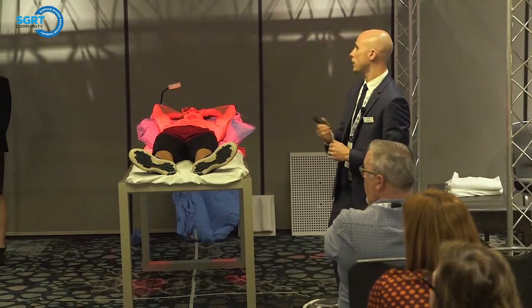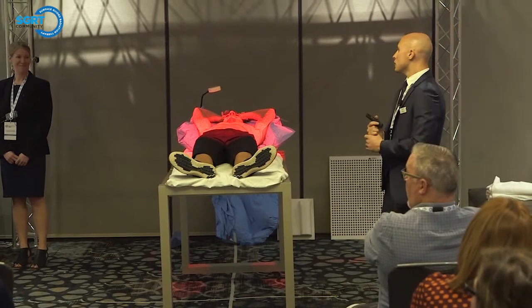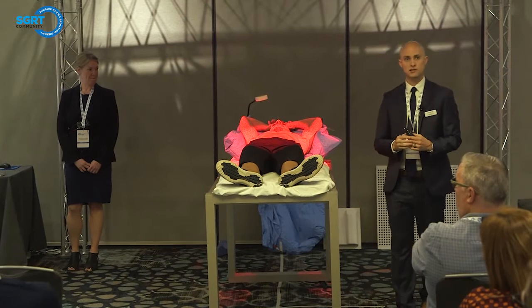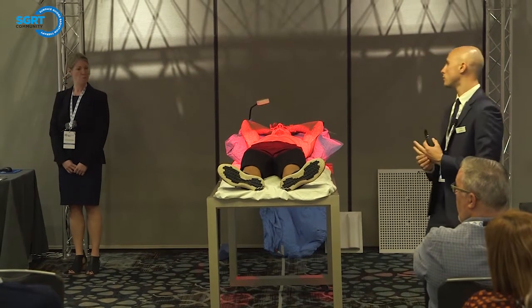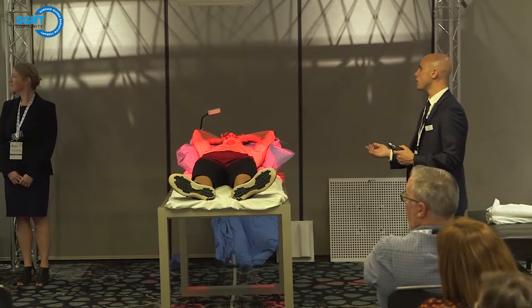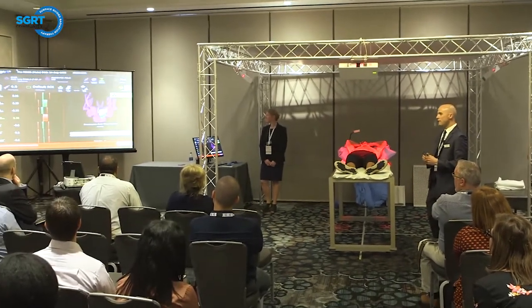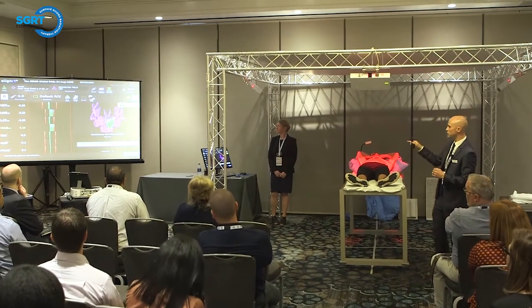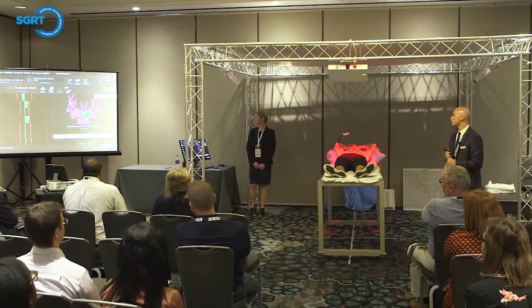Okay, so I'm starting monitoring, and it looks like he took about a 2 centimeter breath in during sim, which is pretty good. From here on out, we can coach our patient to try and assume that same position he did in sim, or he can use the patient feedback device. Again, that's an optional purchase, but it is greatly beneficial for those patients. So if I instruct my patient, go ahead and take a breath in and hold it, he's going to try and get that colored bar in the middle of the white bar. Once everything is completely in tolerance, that bar will go green. You can see that he's actually achieved that position, and it was yellow. That's because one or more of the deltas was out of tolerance. So those are the 2 colors you're going to see.